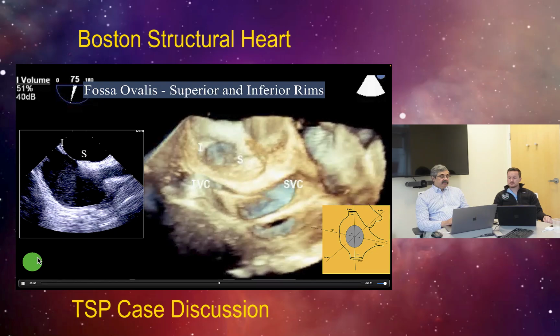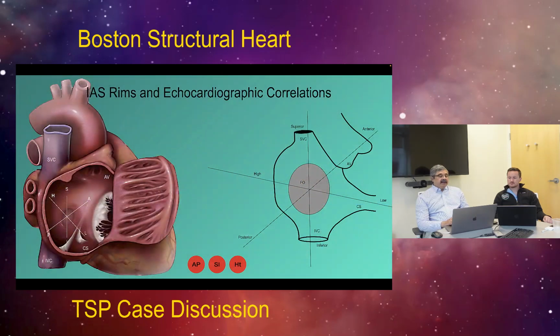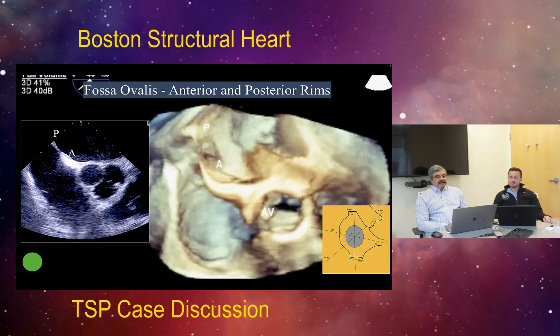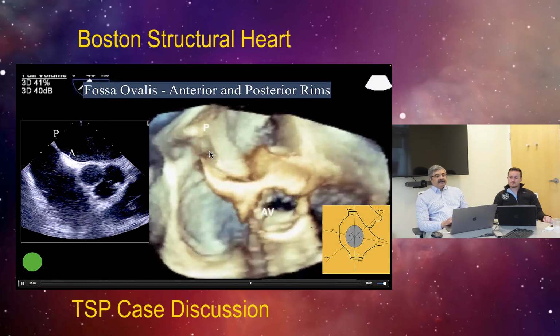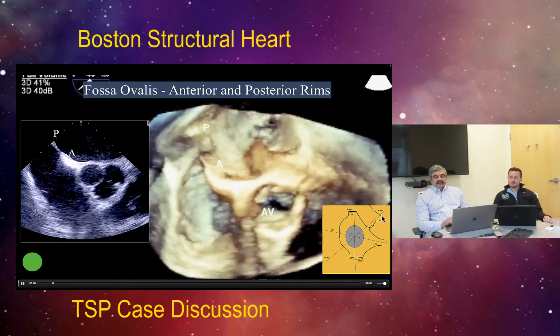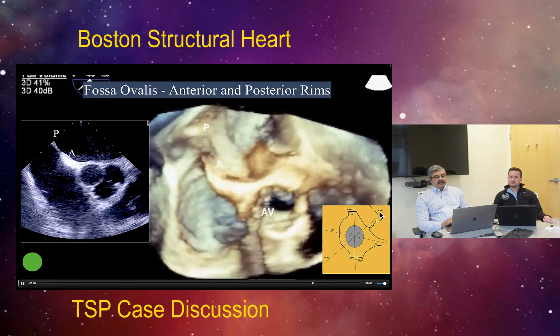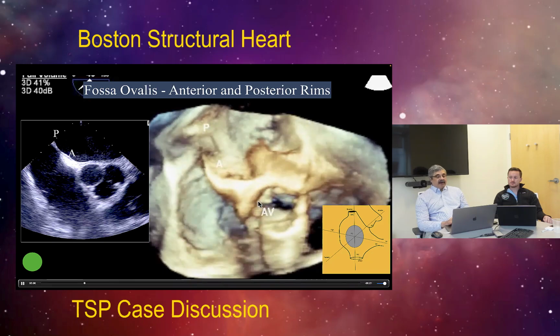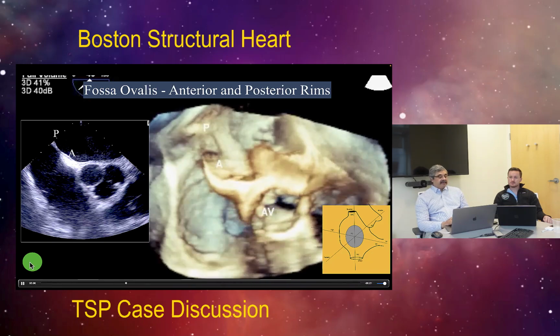Then we go back to the image. The anteroposterior arc goes through the aortic valve somewhere over here, and the posterior aspect is somewhere above the inferior vena cava, so that would be the anteroposterior aspect of the intraatrial septum. That's the aortic valve. That's the anterior, that's the posterior. That's the same thing being shown in the mid-esophageal aortic valve short axis view, and that's the section through the aortic valve, which more correctly demonstrates what we are looking at. Particularly, the posterior margin is rather ambiguous as to what it really represents.